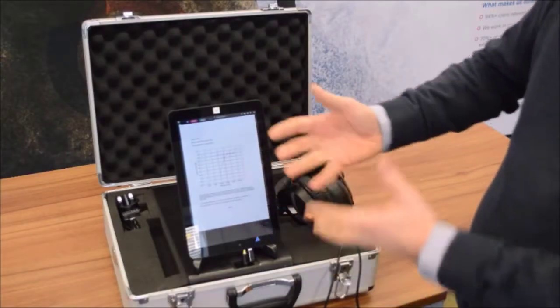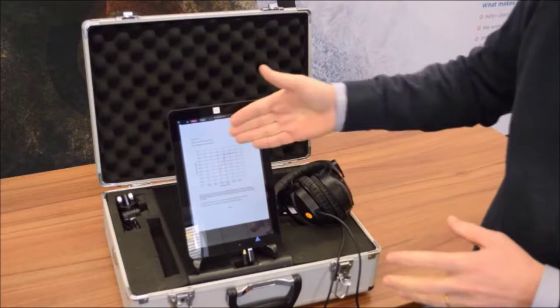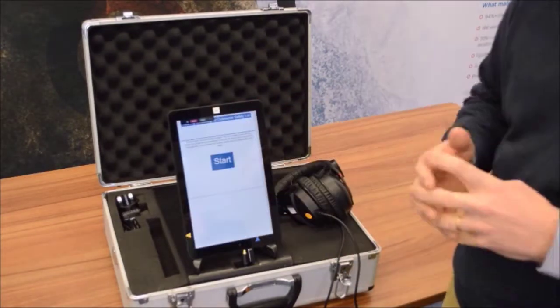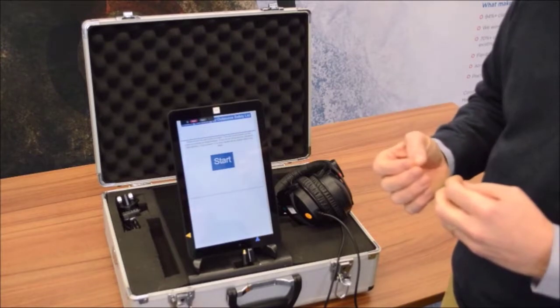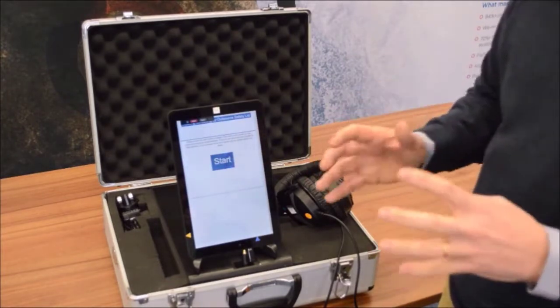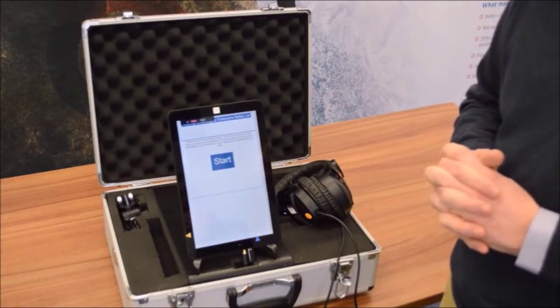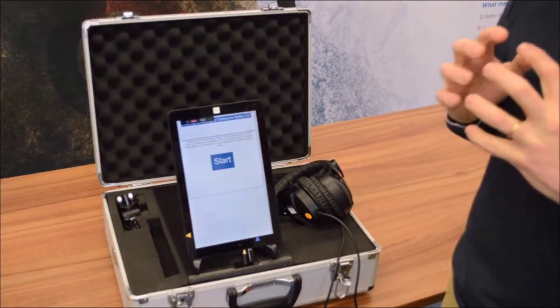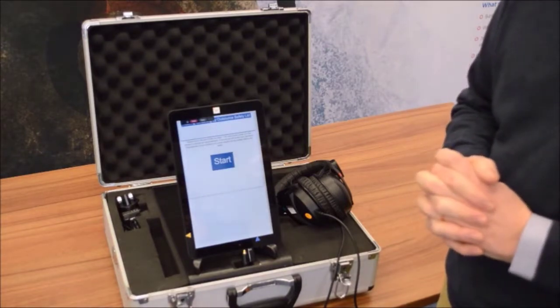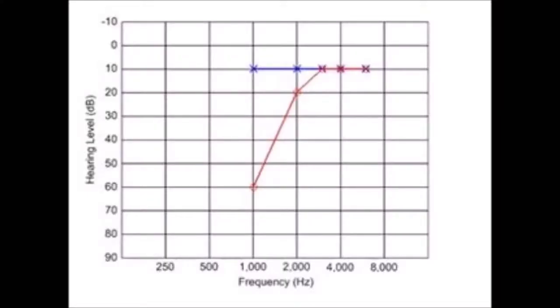And so that's going to display our Mr. Hart, the date, and we can also see our test. And actually, we've run through this to illustrate this, and so you might not normally see the same graph, but it certainly highlights anything where there's a problem. And that same graph is going to be sent back to me, so that I've got a record of that in my email. And if I've given consent, I'm also going to get a record of that from my employer as well. And it's as simple as that.